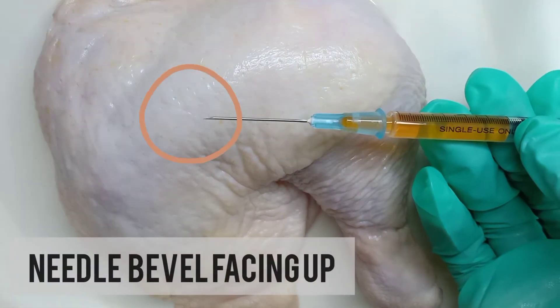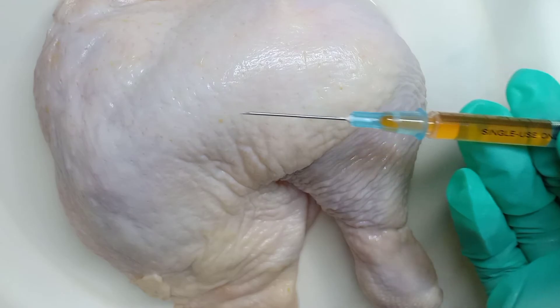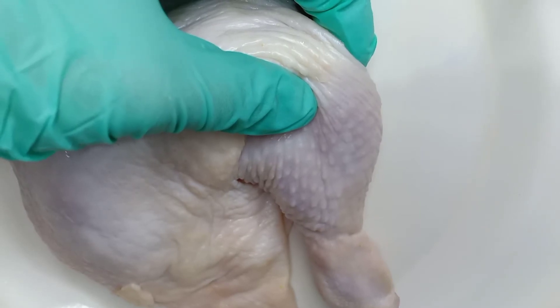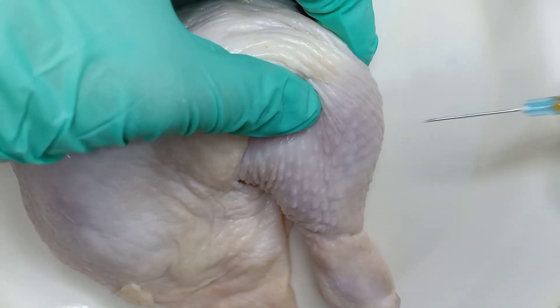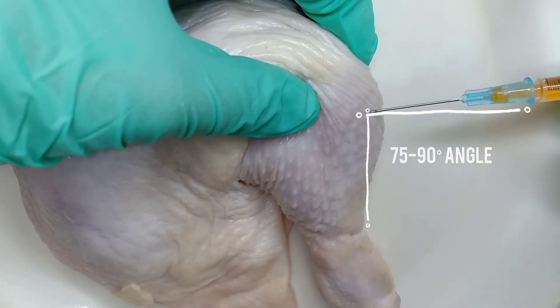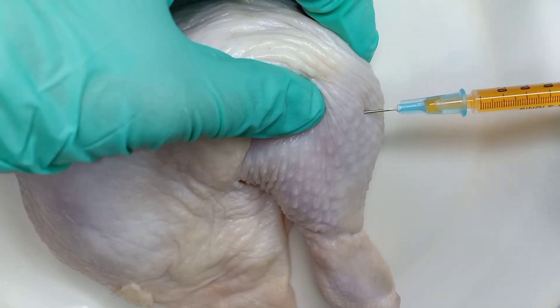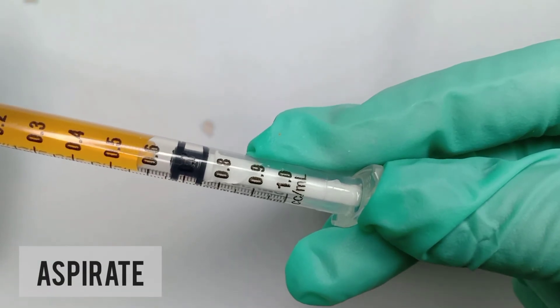Make sure that the needle is beveled facing up upon insertion. Using one hand, pinch the muscle and inject at around 75 to 90 degrees in angle between the muscle and the needle. Prior to injecting the medication, aspirate first.